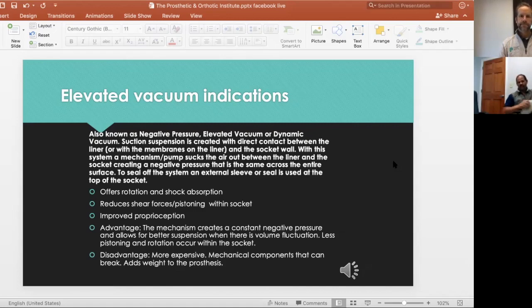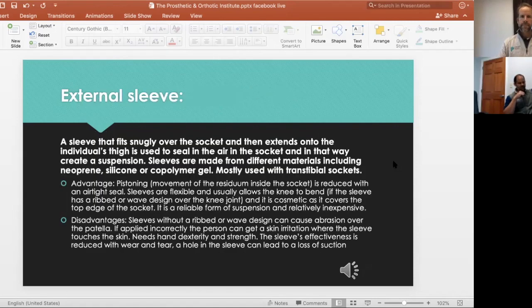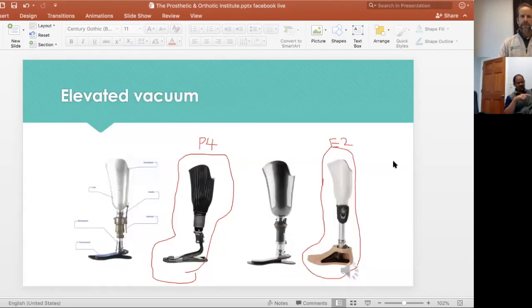With elevated vacuum, again, some folks will say, well, how does it work? How many different systems are there? Ottobock, for example, has multiple elevated vacuum systems that work. Four specifically, I think they're on my next slide here. You'll go to that for me, Russ. As we're talking about elevated vacuum systems, you see the second one here in your screen. It's called the P4, and then the E2 on the very back side there.